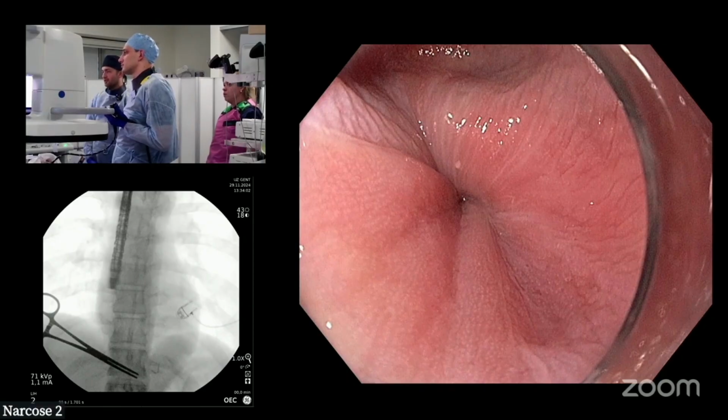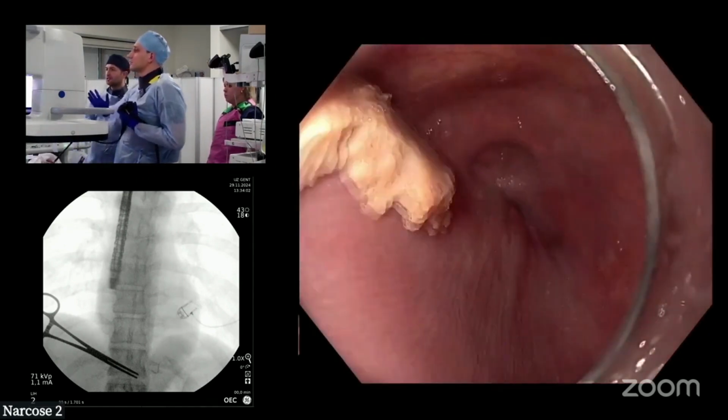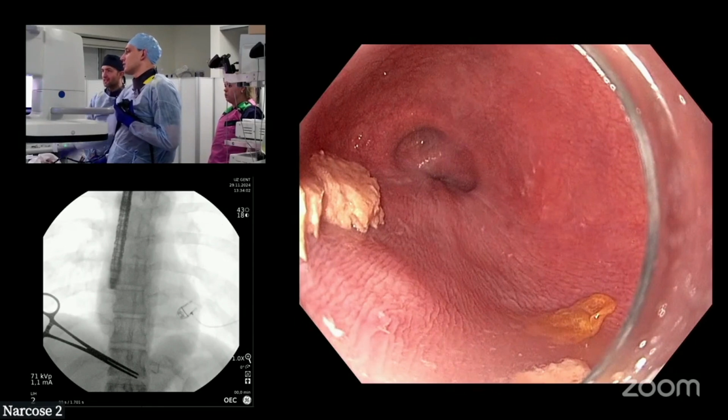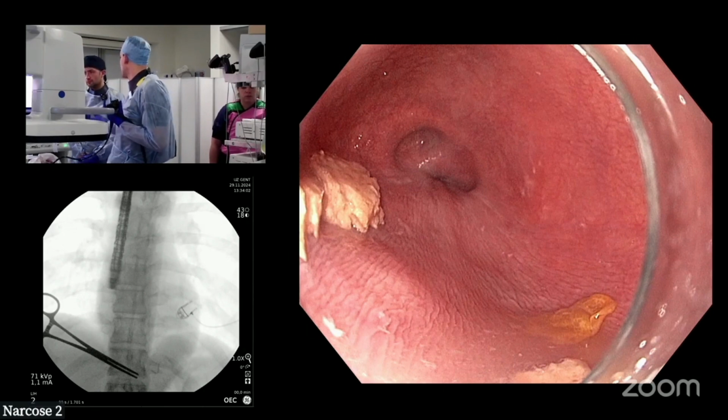So let's assess the lower esophageal sphincter. So here we are. We'll just come back because there's some really nice features here. Stop, pause, right. What are the features of stasis present on this image? You can see chronic esophageal inflammation, this aspect of the esophagus that is like wet papier-mâché. Yeah, like your skin's been in the bath for too long, like you're wrinkled if you've been in the swimming pool for too long. Exactly. Esophagus is the same.